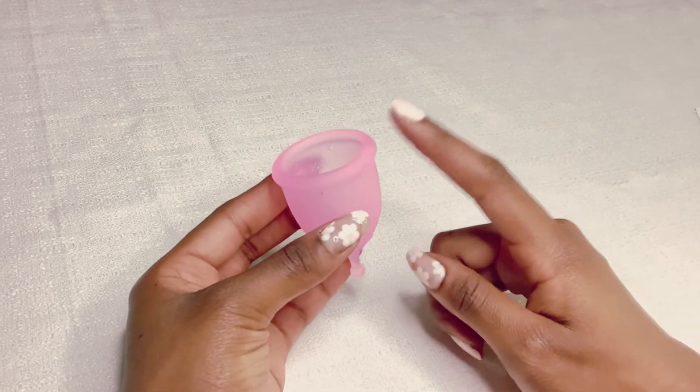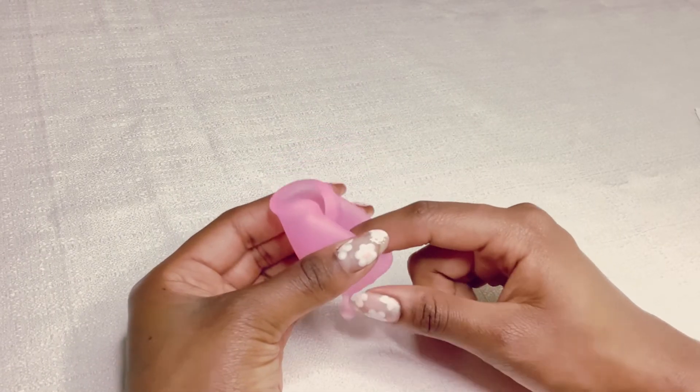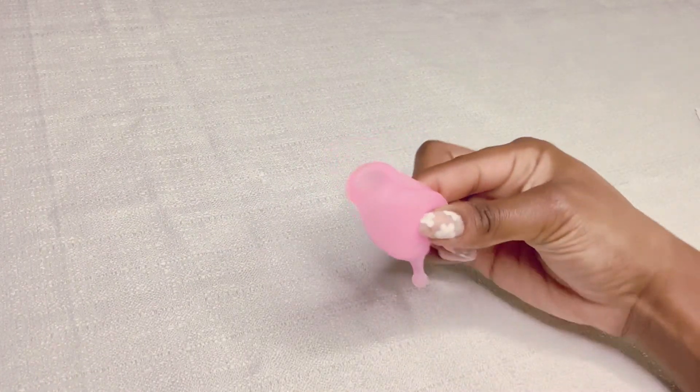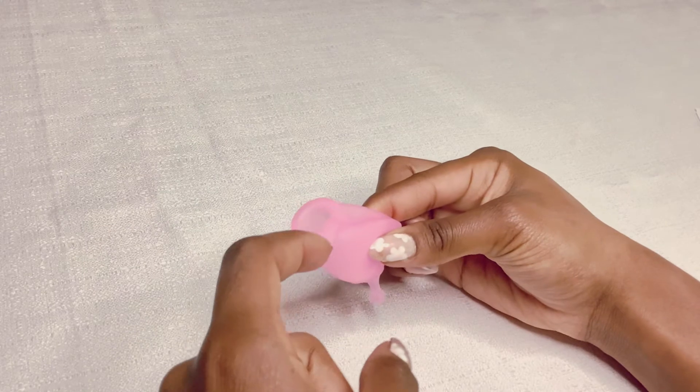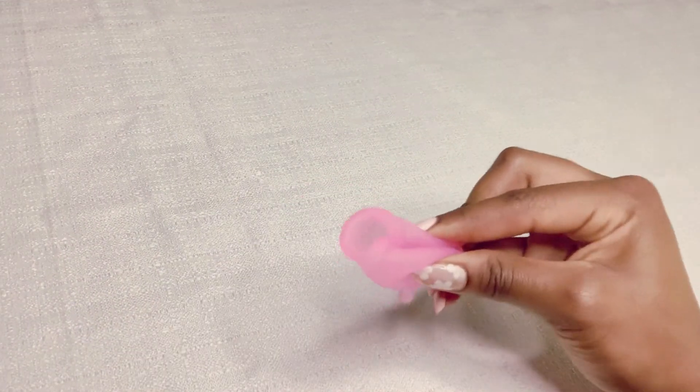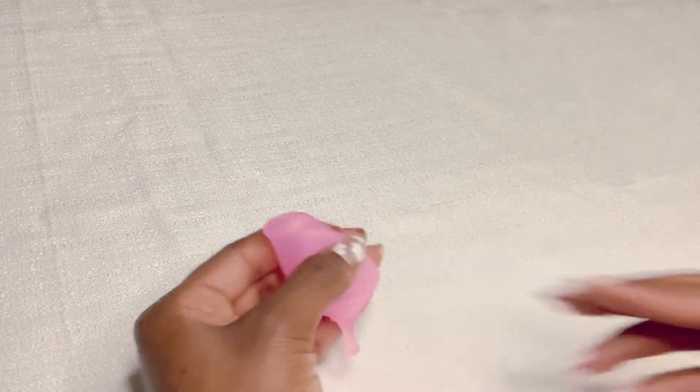So next is the punch down fold. If you're having trouble using the cup, we recommend using this fold. It's called the punch down fold because you take the top of the cup and you punch it down to the middle of the cup. When you do this, it creates a very small insertion place that's very close to the size of a tampon. To get this fold to pop open, you can push on the base and it'll pop open easily.